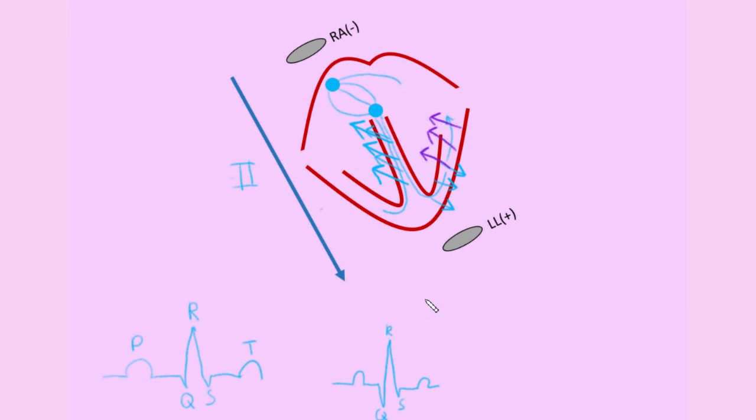So in a patient with HCM, on an EKG, you may sometimes see what is called a dagger-like Q wave. So you have a Q wave that's of greater amplitude, but it is still narrow and it's not widened. And this is due to the greater amount of depolarization going on in the interventricular septum.